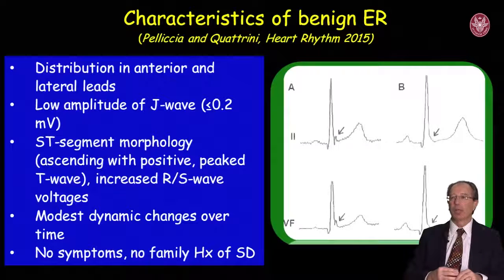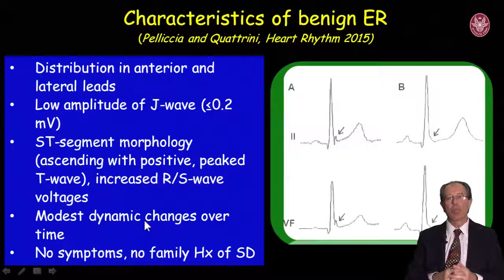We were able to observe changes over time, in that at peak training, this J-wave becomes more evident, and with detraining, the J-wave even disappears. And these electrocardiographic changes occur in the complete absence of symptoms, of events, and no family history of sudden cardiac death.